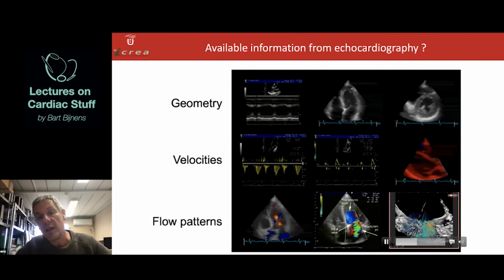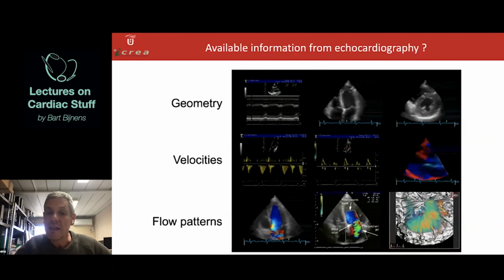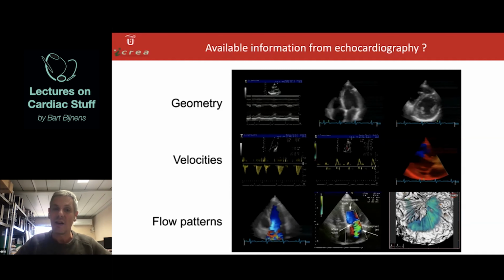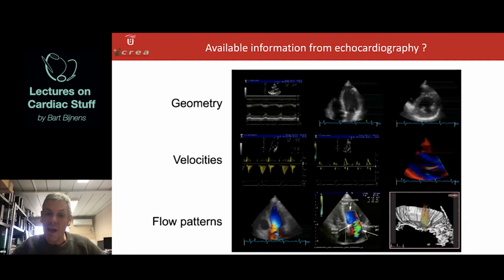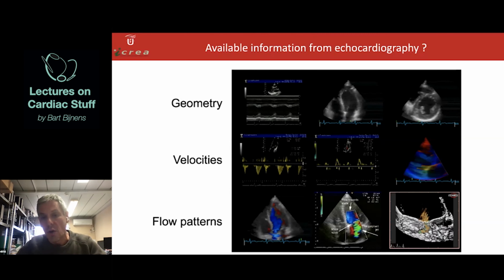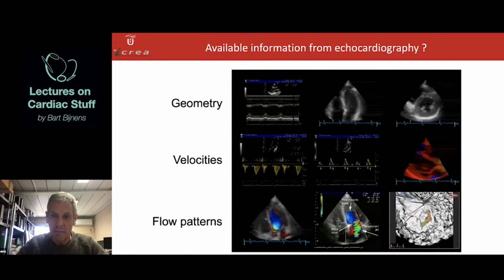We can look at 3D Doppler, but as I mentioned before, while 3D is nice and probably the future, at this moment technology in ultrasound and also MRI is such that frame rates and spatial resolution are still relatively low, and it's not always easy. But by integrating data, I think we still can get the most out of it.